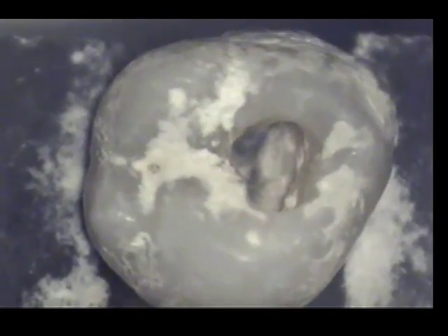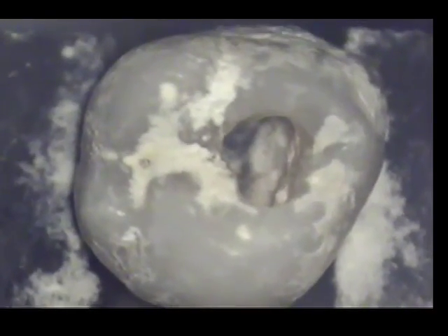Once the depth is gained, the next effort is in making the occlusal access wide enough so the entire floor of the pulp chamber is clearly visible. While we want adequate access, we don't want to remove any more coronal tooth structure than is necessary. As you can see here, the mesiobuccal canal is hidden under the mesiobuccal cusp, and the distal buccal cusp still appears to be hidden under some distal buccal tooth structure. We are slowly removing overhanging dentin and enamel to more clearly visualize the entire floor of the pulp chamber.